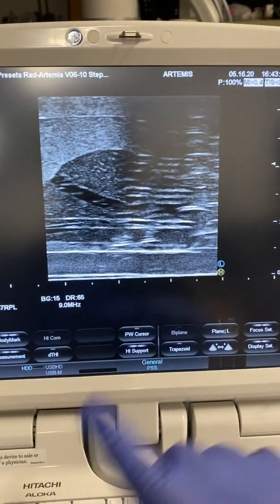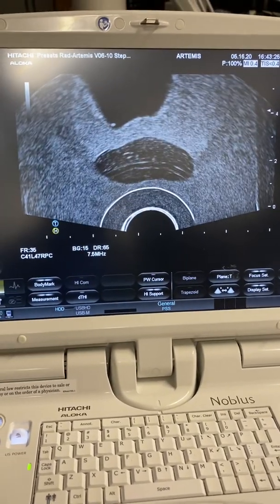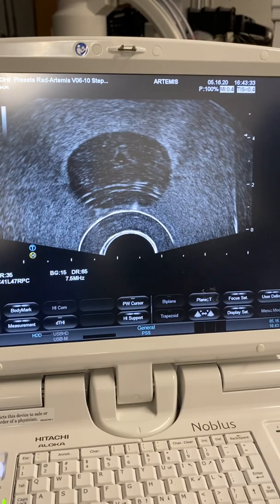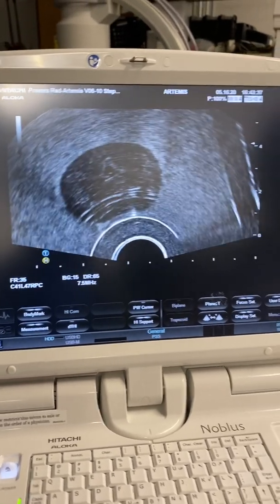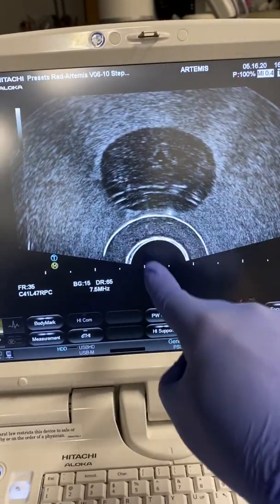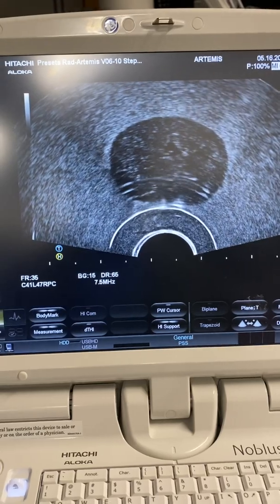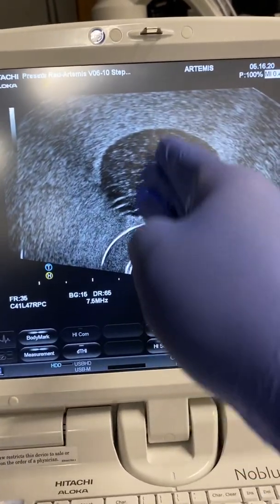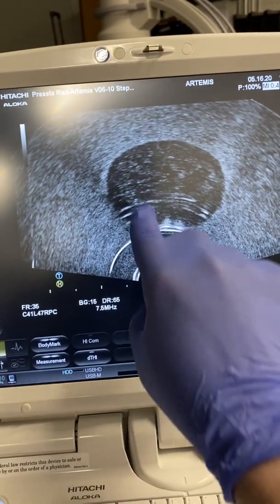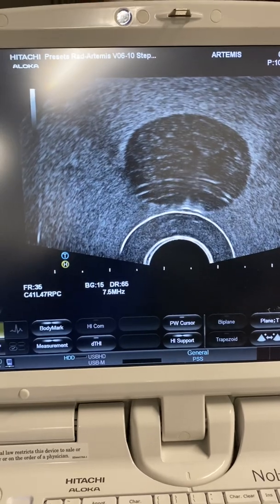Same as they did on fiducial, they're going to have you switch to axial. Come back - you should still be centered underneath the needle since you don't have to spin the probe at all. For this part, they want to center the gland to the probe to confirm we're placing the gel midline. They can wiggle the needle to confirm position. They want to be midline because the gel needs to spread equidistantly to both sides of the gland - if the needle is off to one side, the gel won't spread to the other side and that side will get radiated into the rectum.